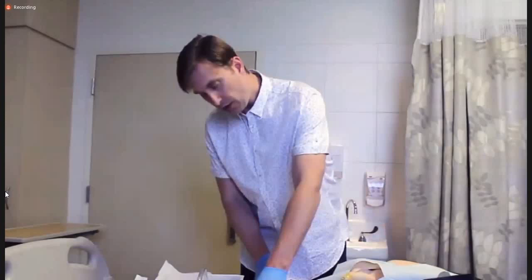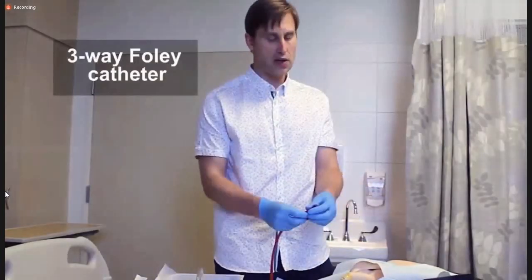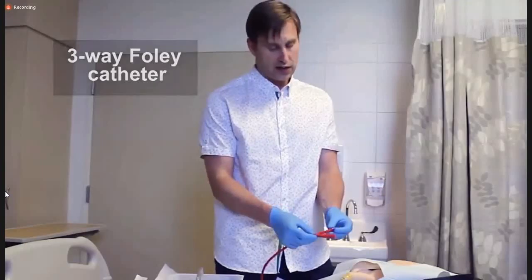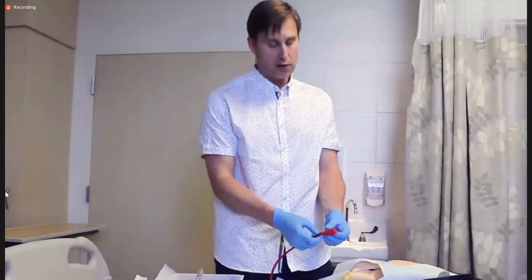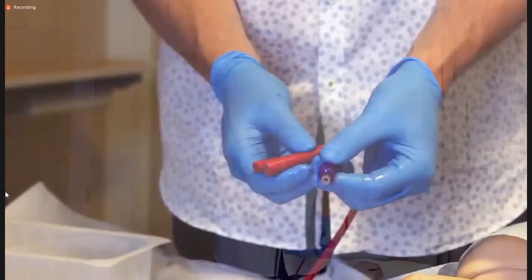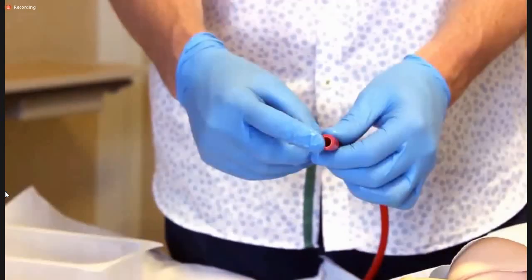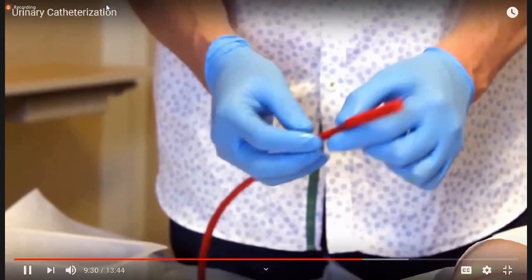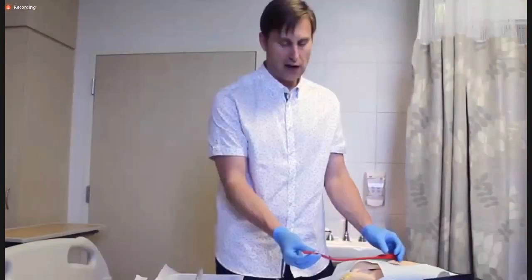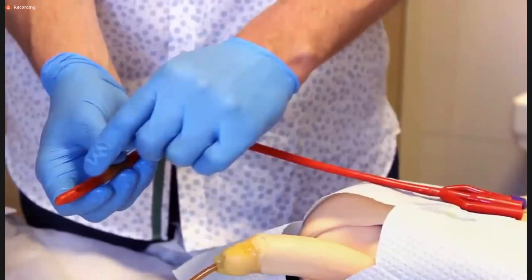Another type of catheter that we have is called a three-way Foley catheter or three-way urethral catheter. In these instances, it's very similar. You have a balloon port, and in this case, this is purple, tells you that it's 22 French. You have a drainage port where the urine will drain from, but the key difference is this third port. And this third port allows fluid to flow into the bladder. So you have a series of ports, one for inflow and others for the outflow.